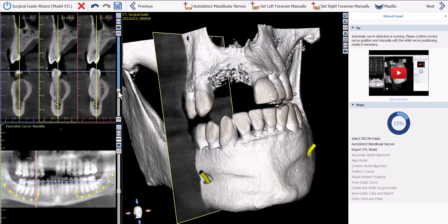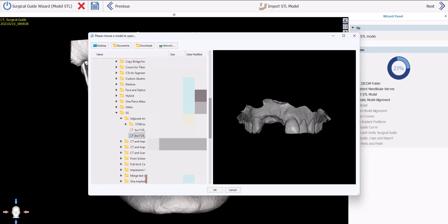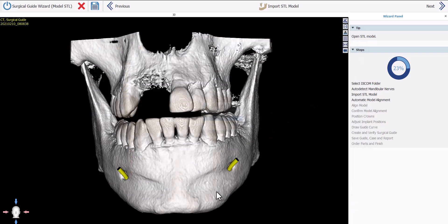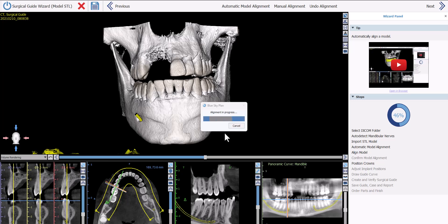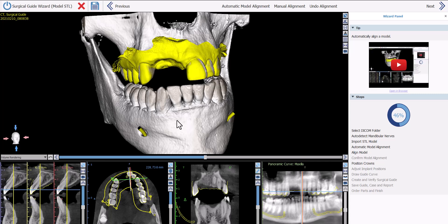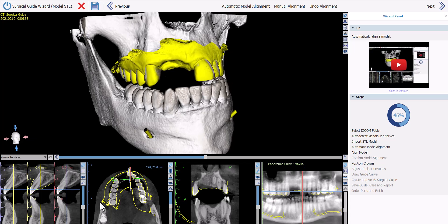Once satisfied with the nerve detection, click Next. The software now prompts us to select and import the relevant model or intraoral scan. Navigate to the relevant model using the shortcut buttons or folder structure, left click to select, and click OK. The software confirms jaw type — select the relevant jaw and click OK. The software then runs completely automatic model-to-CT alignment, which we can confirm in the 3D view and in the 2D views.